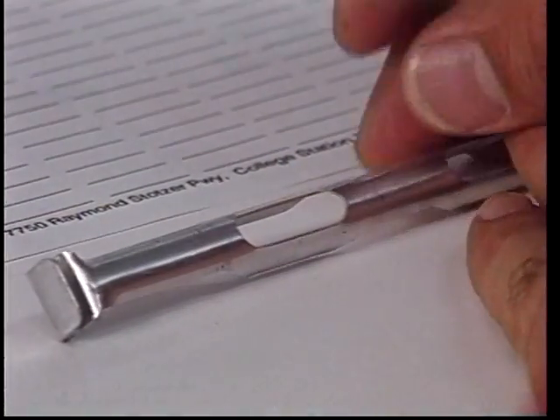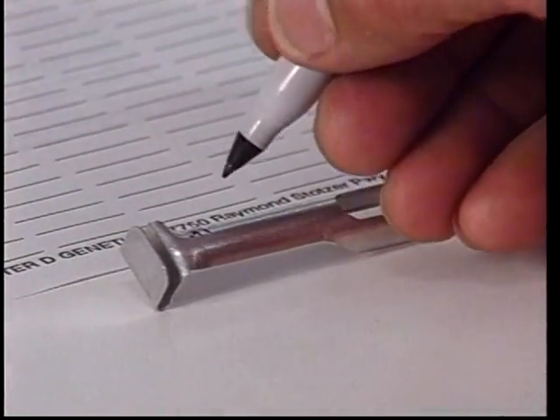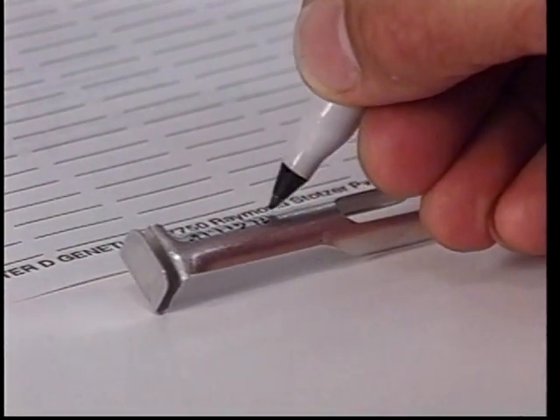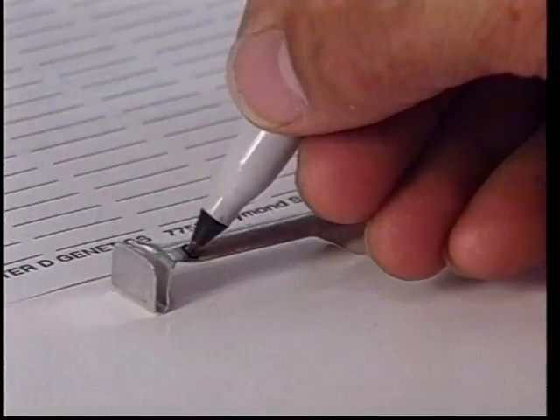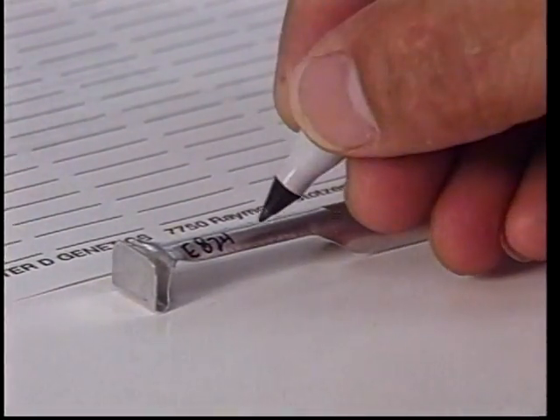This same information needs to be written on the neck of the cane. So we go near the top portion, once again put the breed code, registration number, and the donor's private herd number. We then put the IETS freeze code for our company and the date.